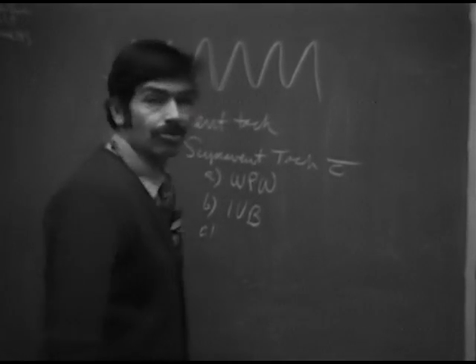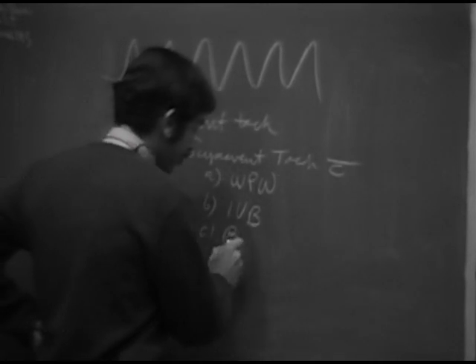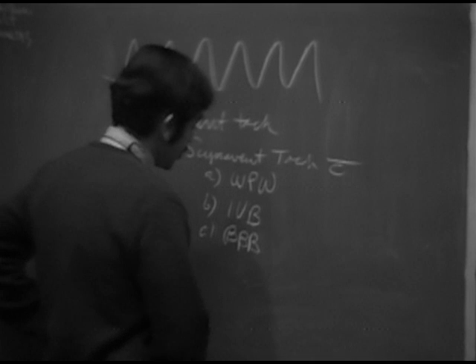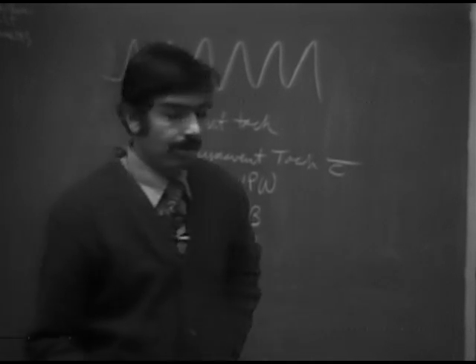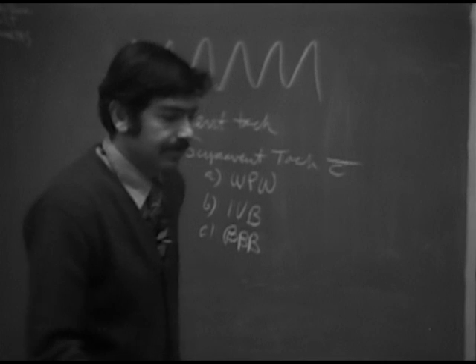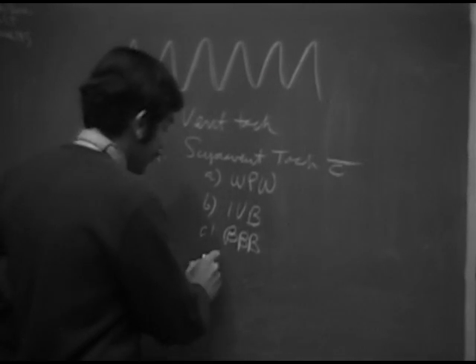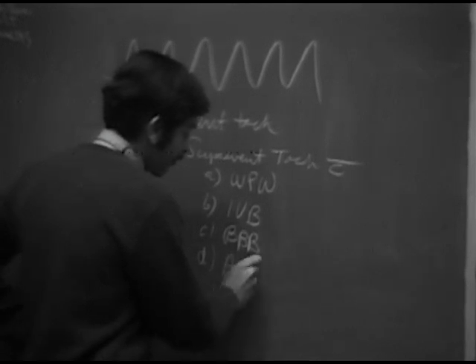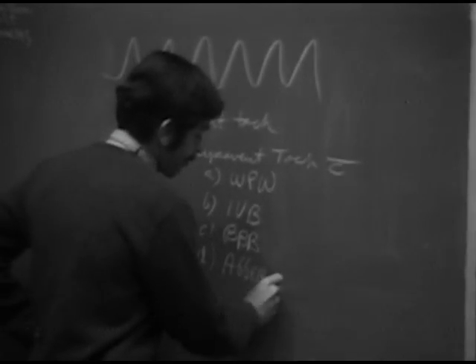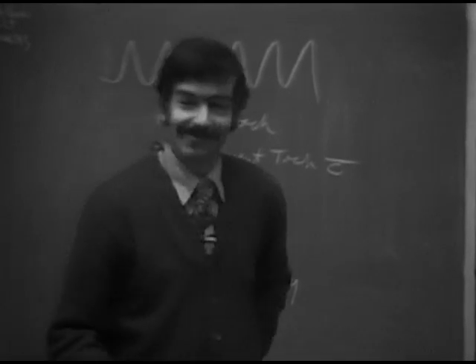If the terminal portion of the QRS is prolonged, we think of bundle branch block. And also a form of rate-related bundle branch block, or as occasionally it's not necessarily related to the rate, aberrancy.